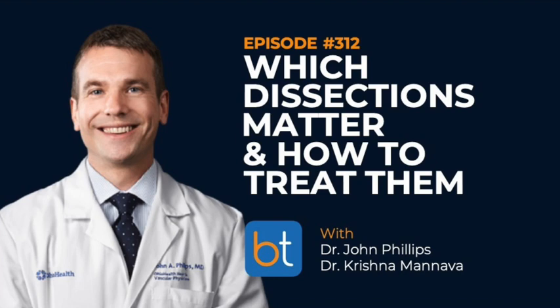And so we were doing a fair amount of stenting of these vessels, and going out to LINC and seeing how other people are doing things, using a lot of just drug-coated balloons alone, we started leaving more and more dissections, or at least thinking about them, and maybe not necessarily having to put a scaffold in. And so for me, I try to assess the flow pattern above and below the dissection.